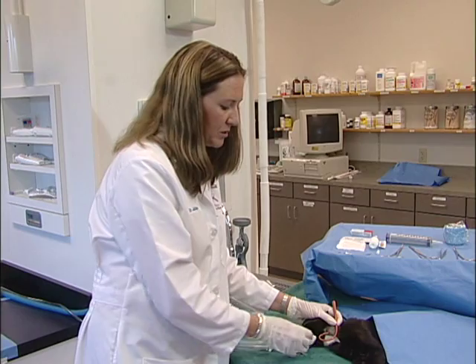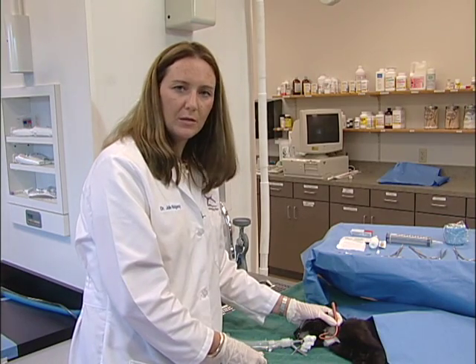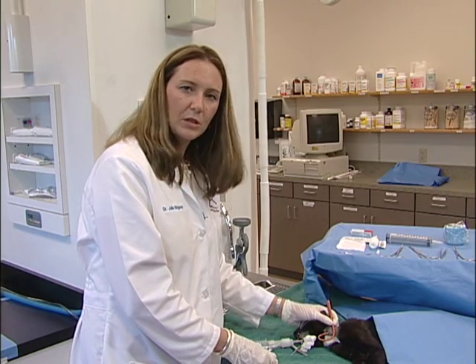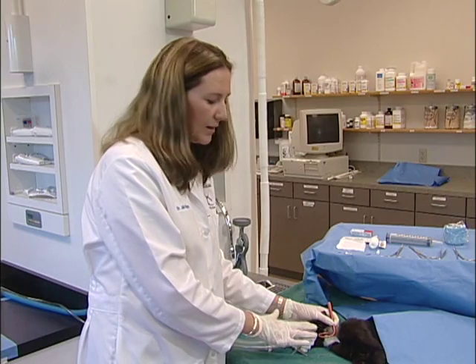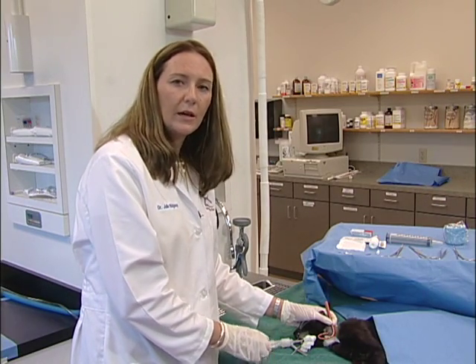Once you have the tube in position, you can go ahead and place a purse string suture around the exit site of the tube and do a Chinese finger suture up the tube. It's then important to apply a sterile dressing with betadine ointment over the exit site, then wrap with gauze bandage and also vet wrap.